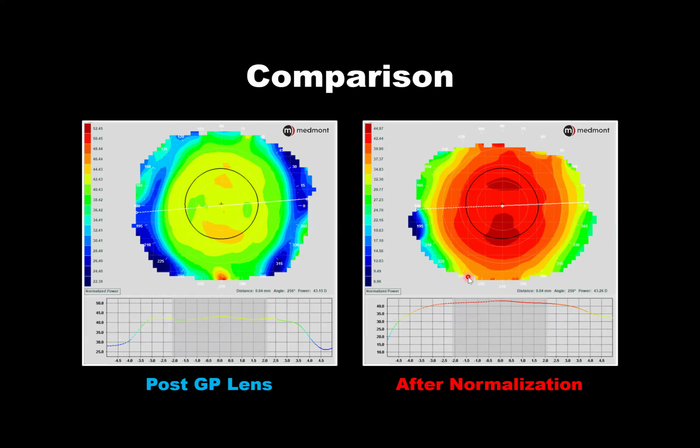Como pueden ver el lado derecho, una vez que no se usa más el lente, esperamos y le damos tiempo a la córnea para que se normalice, pues miren cómo cambia el perfil grandemente. De aquí la importancia de utilizar mapas como estos si vamos a hacer ortoca o el ejemplo que puso Randy de cirugía refractiva. Obviamente, esperar que se normalice.